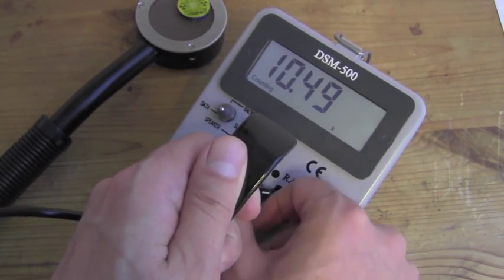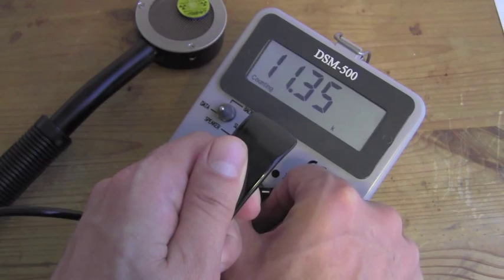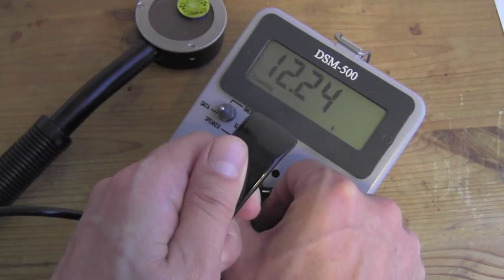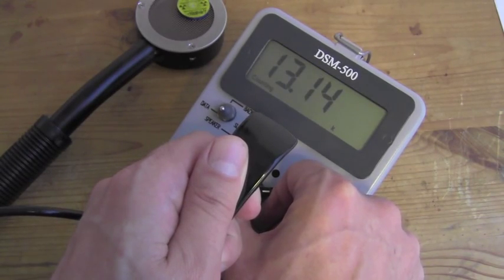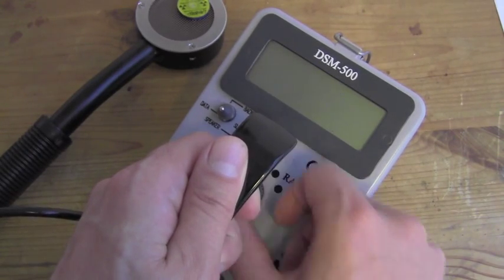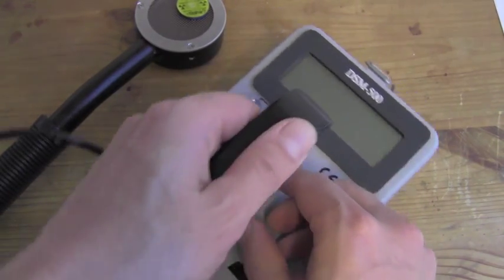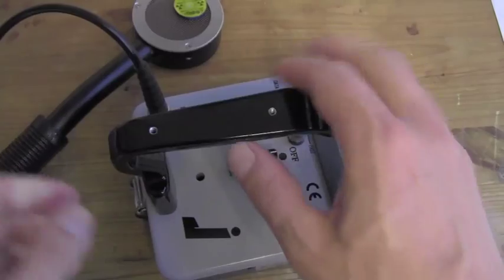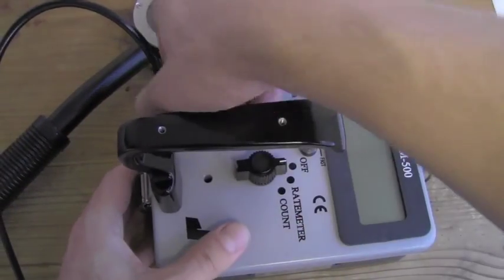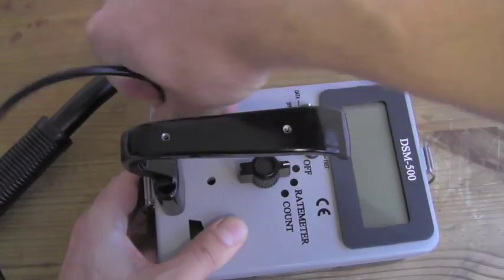Today we are not going to wait. We are going to have a look inside of the survey meter. I am going to turn that off and remove the cable.